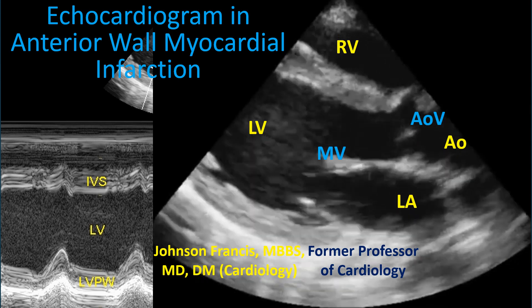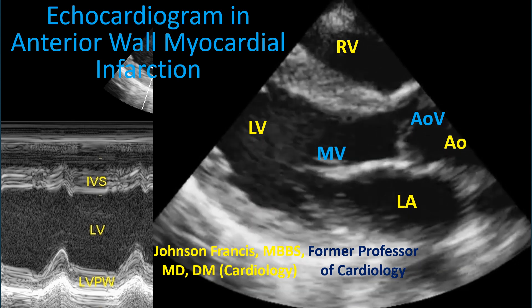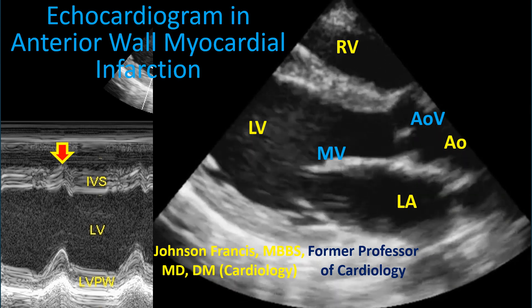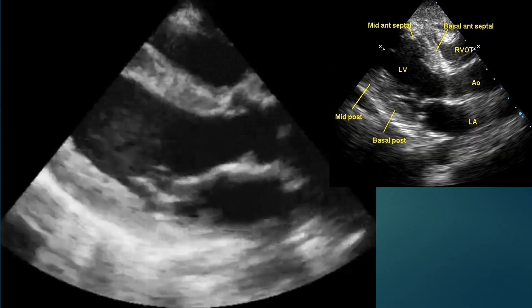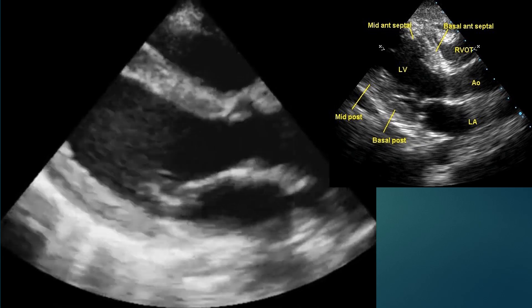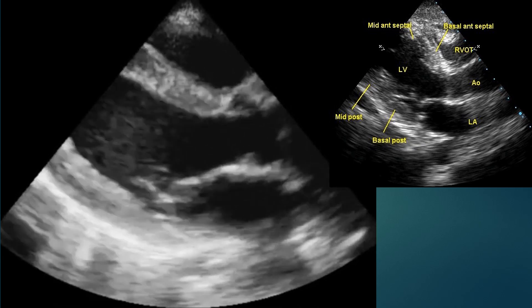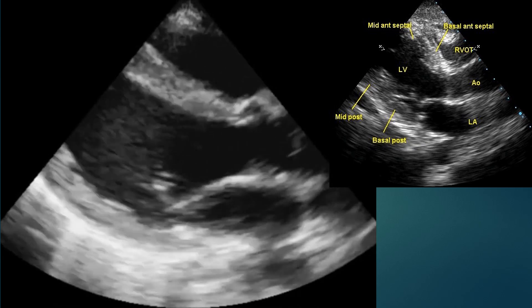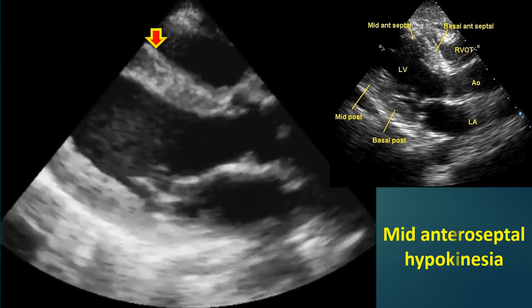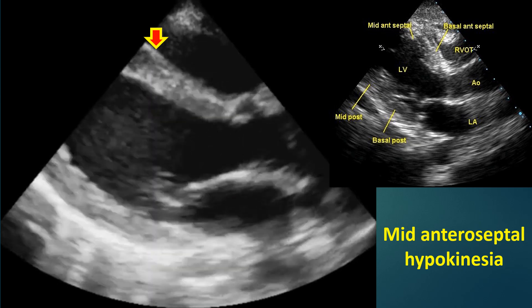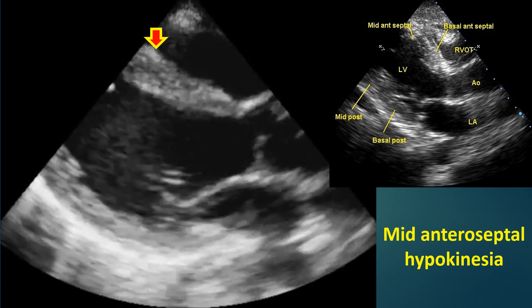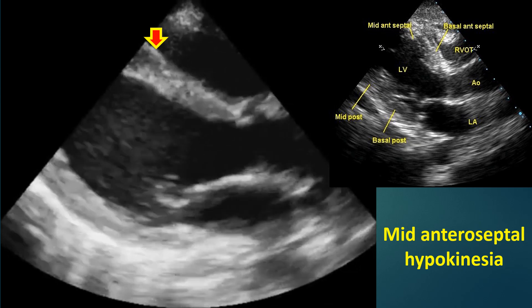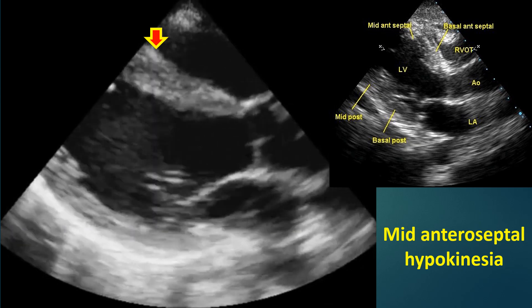M-mode echo shows poor contractions of the interventricular septum. Parasternal long axis view showing hypokinesia, or reduced contraction, of the mid anteroseptal segment of the left ventricular myocardium. This is due to anteroseptal myocardial infarction.